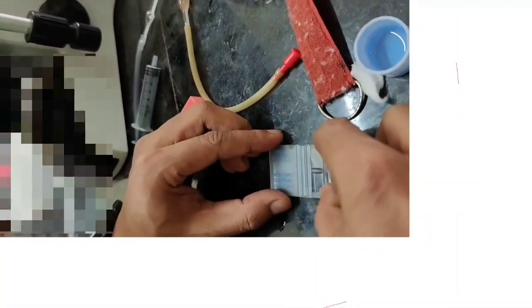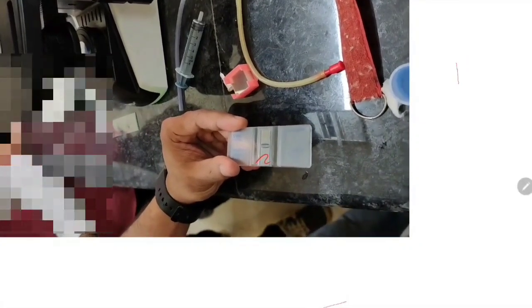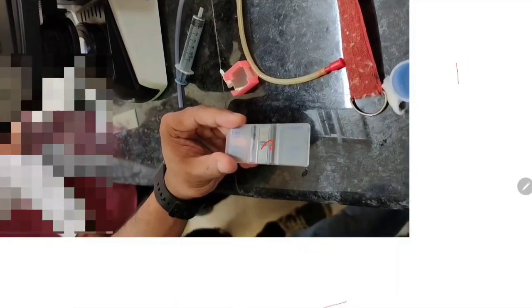Now we are ready with the slide and we are putting the cover slip, and just cleaning the cover slip with dry cotton to remove any dirt present there. Now this is the thick cover slip on the Neubauer slide. Here the side pillar is higher than the central pillar by 0.1 millimeter.